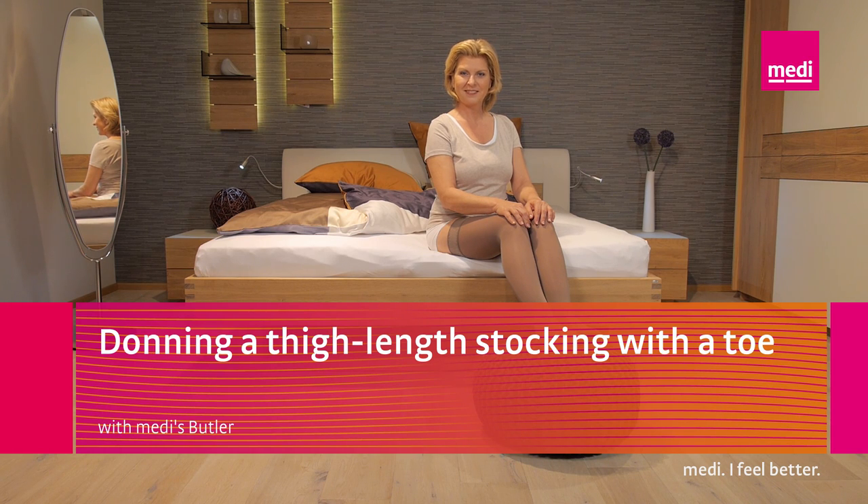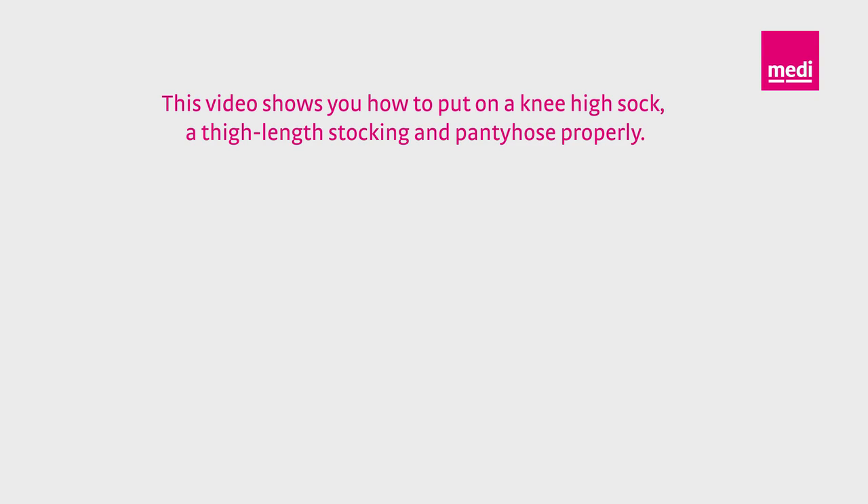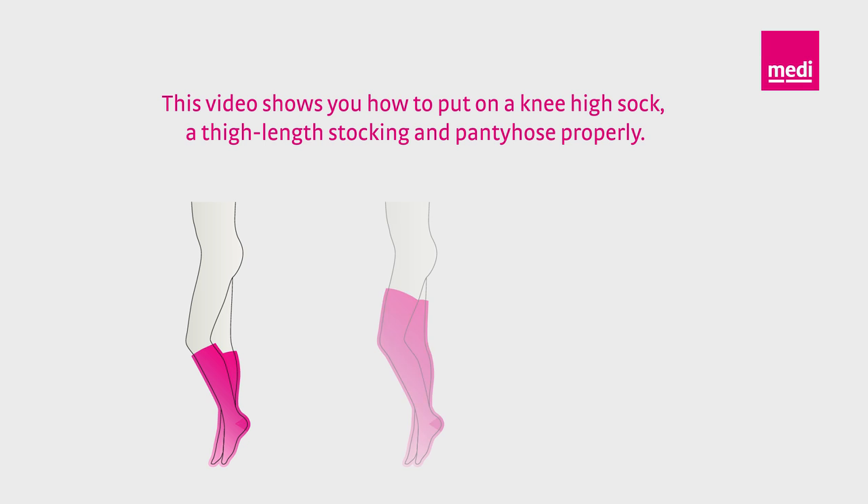How do you put on your Medi-Ven compression stockings properly with a Medi-Butler? This video clip will give you some valuable tips, because it's really easy once you know how. This video shows you how to put on a knee-high sock, a thigh-length stocking, and pantyhose properly.